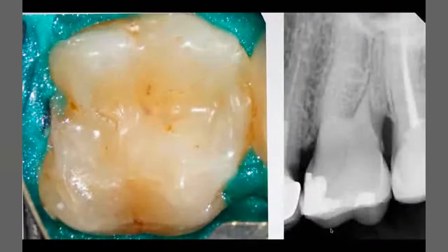Another case, also an upper molar, completely calcified pulp chamber, but the patient has symptoms. She has pain on percussion. She cannot bite on this tooth. She came to me and said, I cannot bite on this tooth, I have severe pain. When I did the percussion test, yes, it was very severe. And I think if we took a CBCT for this case, we would find a periapical lesion on the distal root, because I can see some periodontal ligament widening there.